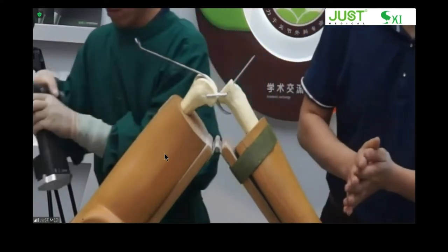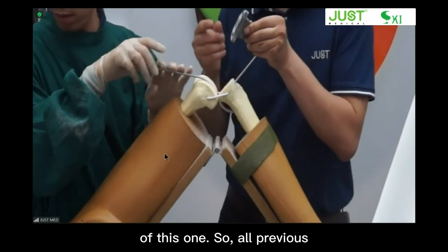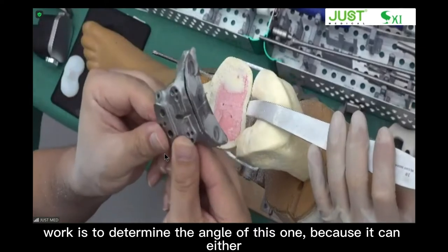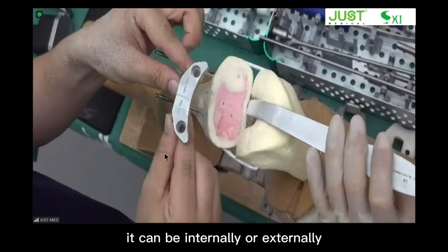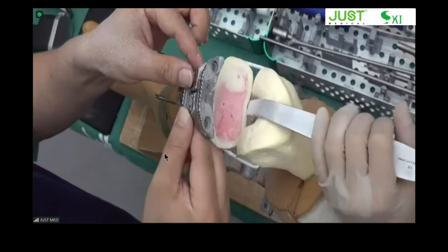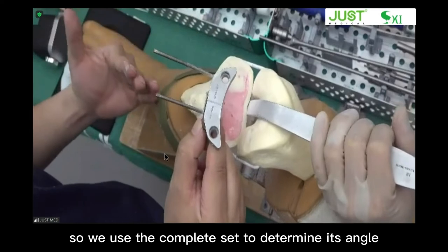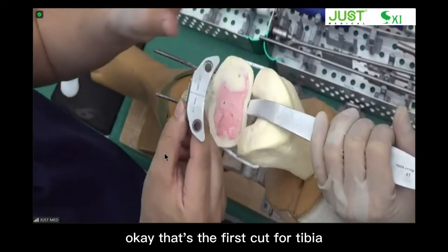Good. Now it's better. So our previous step is to determine the position of this one. Our previous work is to determine the angle of this one, because it can be either higher or lower, internally or externally rotated, and posterior slope can be different. So we use the complete set to determine its angle. Okay, that's the first cut for the tibia.